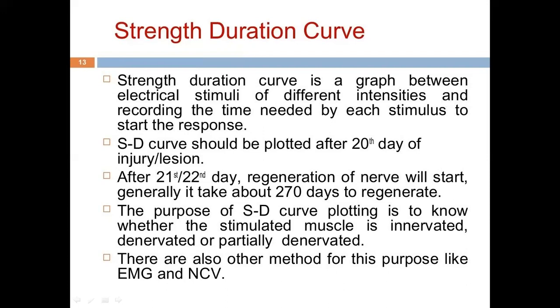The purpose of SD curve plotting is to know whether the stimulated muscle is innervated, denervated, or partially denervated. There are also other methods for this purpose like EMG and NCV, known as electromyography and nerve conduction velocity.